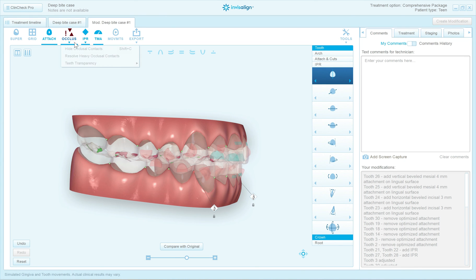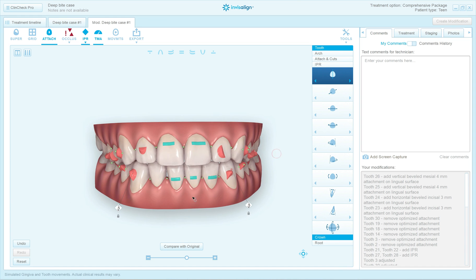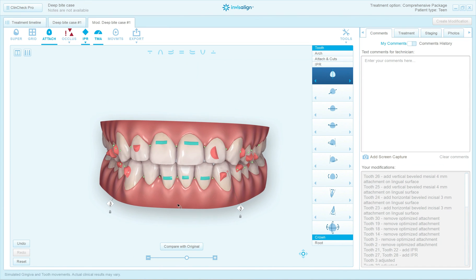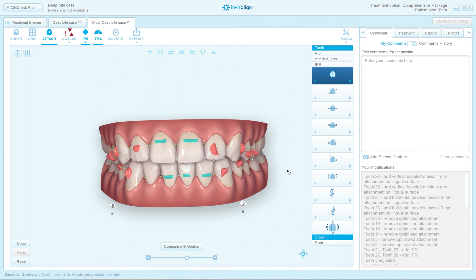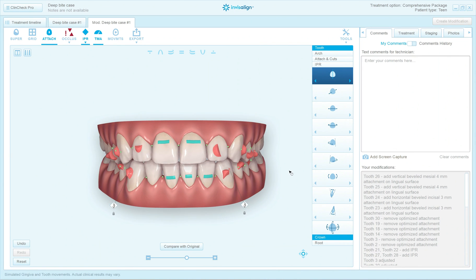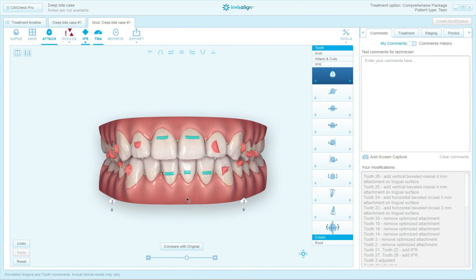So this is how I would set up almost every deep bite case. In some cases there's more crowding and you need more IPR; in others there are tooth size discrepancies requiring restorations. But this is pretty much a class one crowding and deep bite case — a great case to treat. I hope this video is helpful when you set up your deep bite cases. Go create sample cases from some of yours and practice the 3D controls using the sample, and you'll get really good at it.